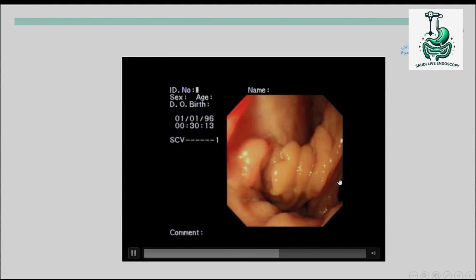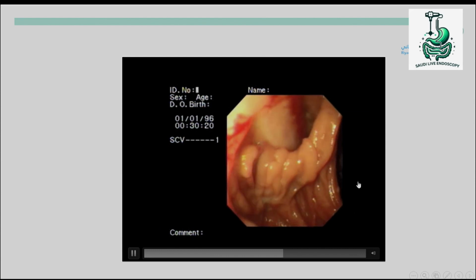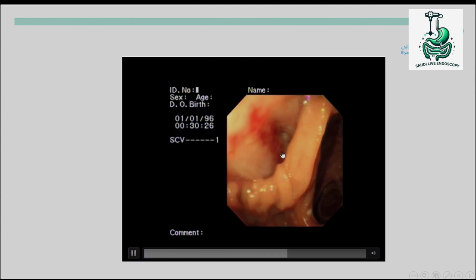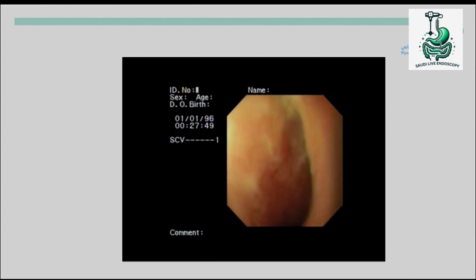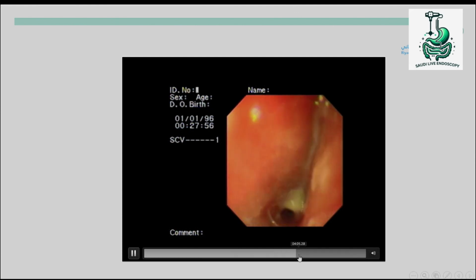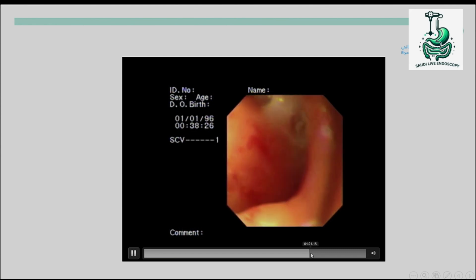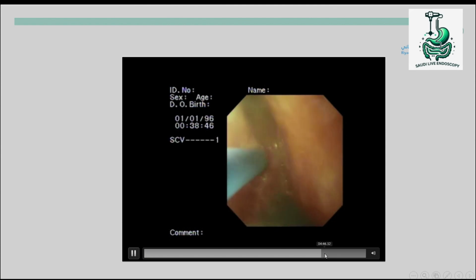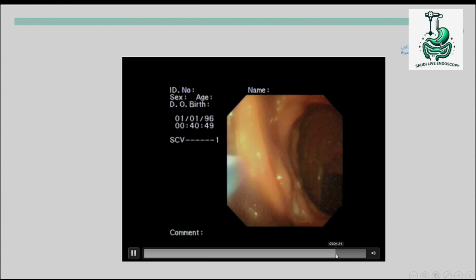You see here, this is the lumen of the jejunum. But there is still a small tract here, which is now becoming a fistulous tract, though we do have some proper lumen now, which is different from what we had before. Now, when you approach this fistulous tract, it's different. This tract is chronic and epithelialized, so you really have to de-epithelialize it to help the healing. This is why we decided to do some de-epithelialization using APC. We try to do some ablation of the edges of the whole tract, right up to the edge. You're trying to create a new raw surface area.